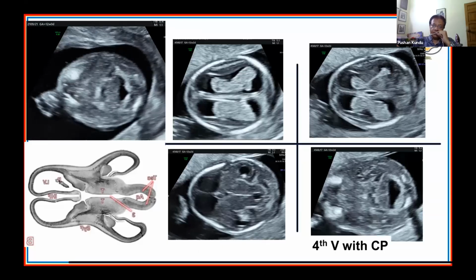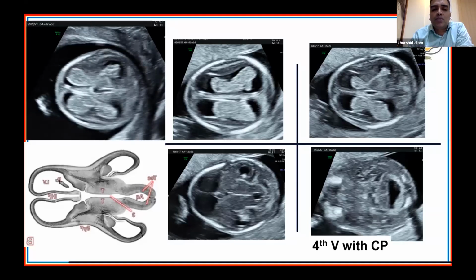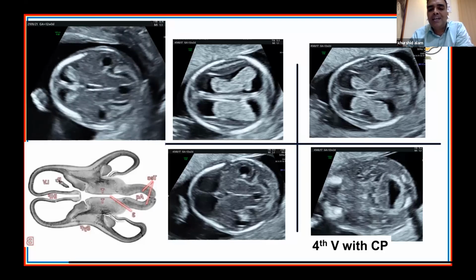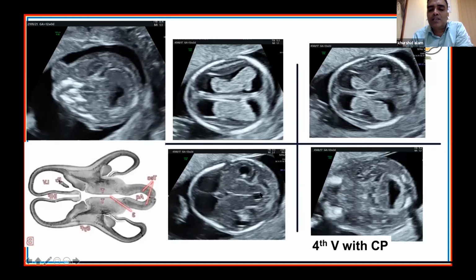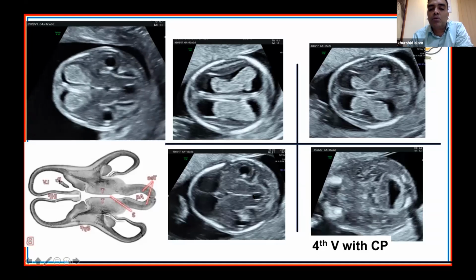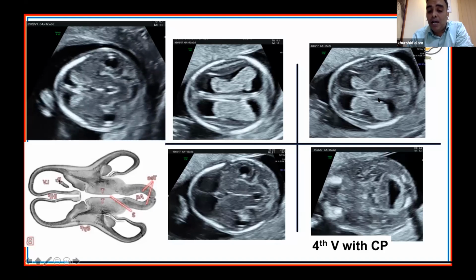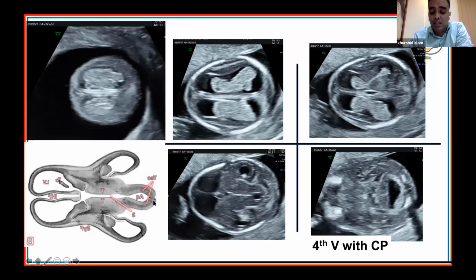Yes. So essentially, we are dividing into 4 sections, where in one section we are looking at the choroid plexus and midline falx, as Dr. Pushan Kundu sir has already said, and then go on to the transthalamic view, where we will be seeing the aqueduct of Sylvius and the distance between the occipital bone and the thalamus, and then go on to the 3rd ventricular view, and then the 4th ventricular view with the choroid plexus, and the same thing you can see in the video clip.